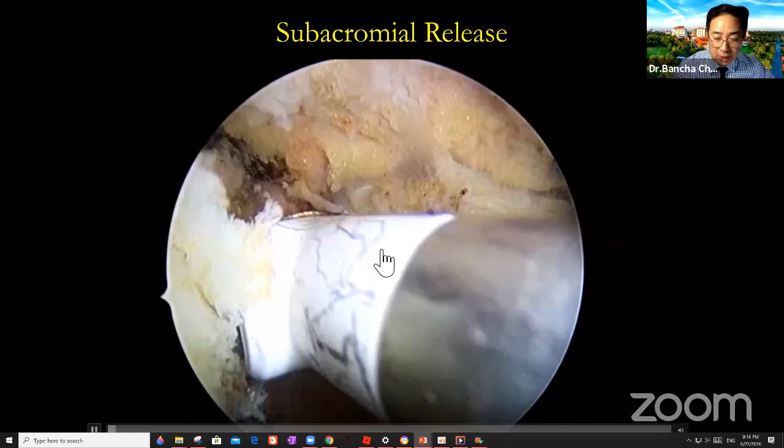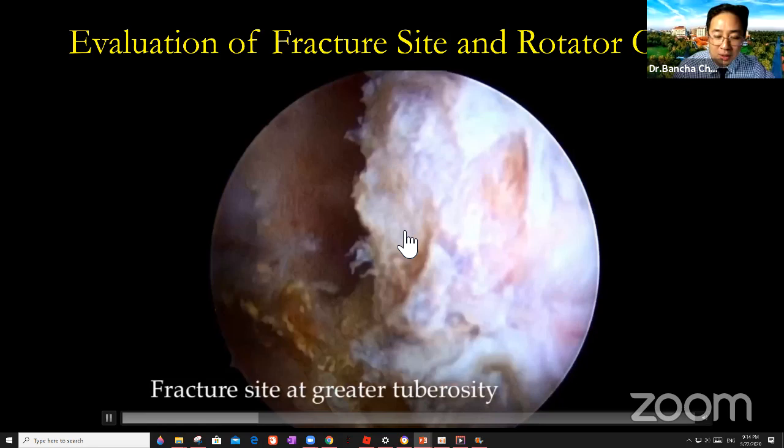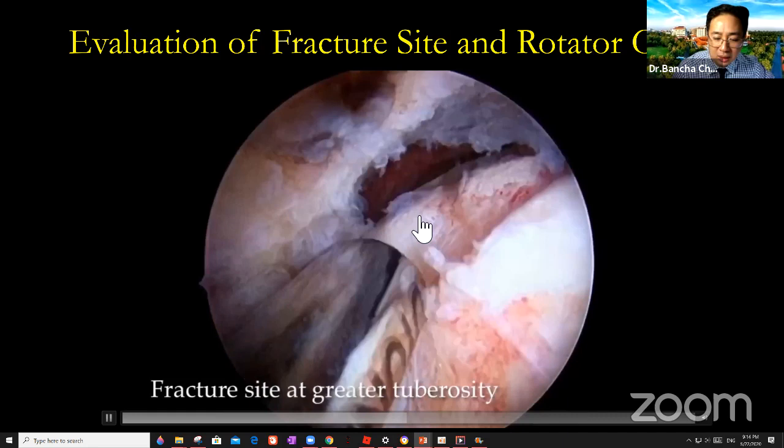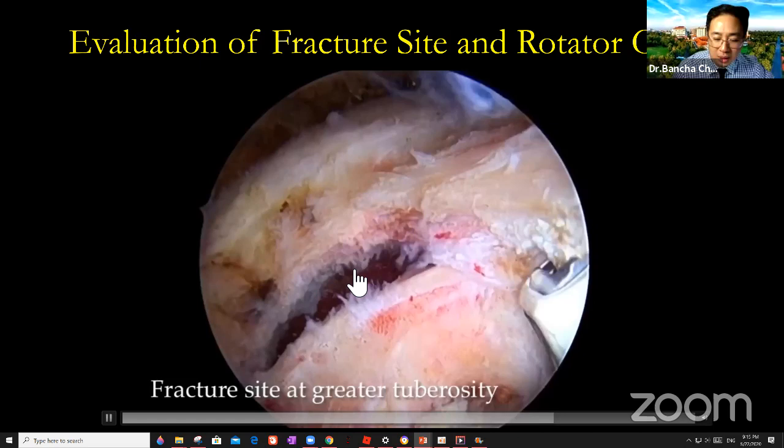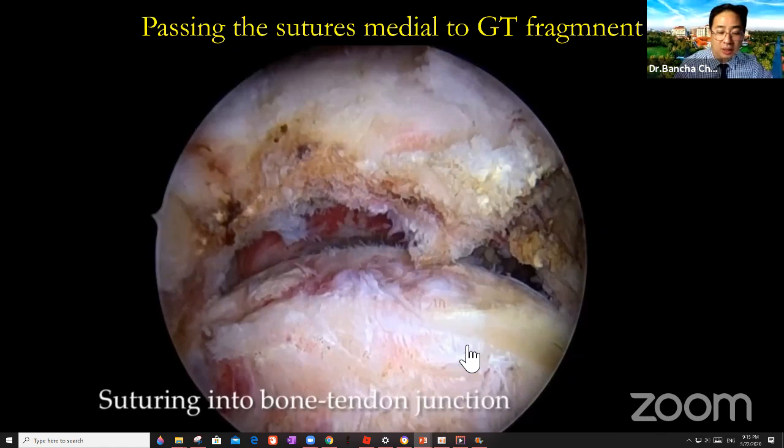Next step is the fracture site and rotator cuff evaluation. I identify the tuberosity. You see that this is quite sclerotic, right? And remove all the bursal tissues. So that is the crater of the GT. After that, that is the avulsion.